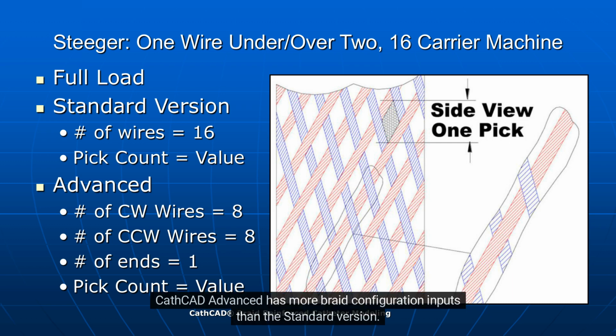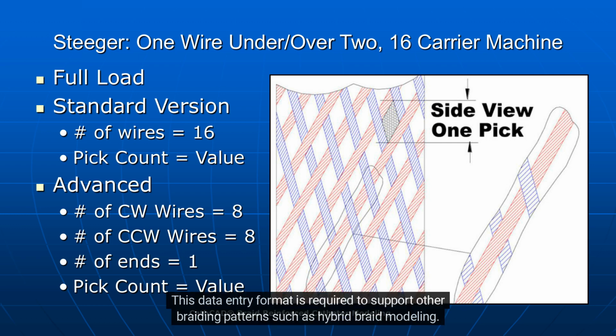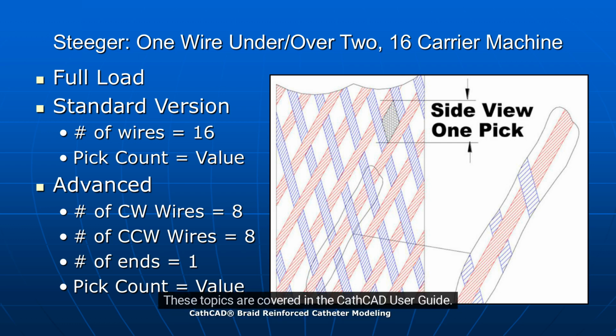CathCAD Advanced has more braid configuration inputs than the standard version. This data entry format is required to support other braiding patterns, such as hybrid braid modeling. These topics are covered in the CathCAD user guide.